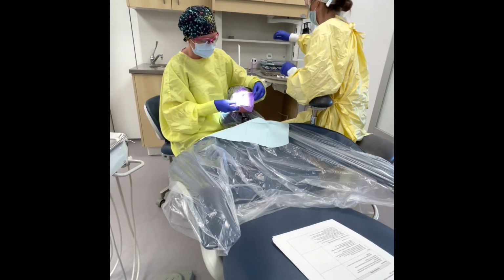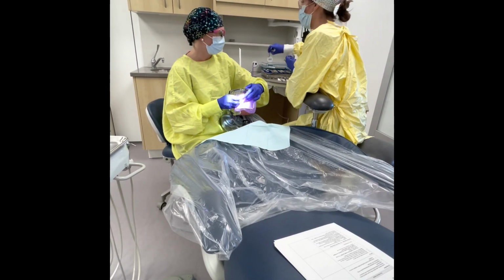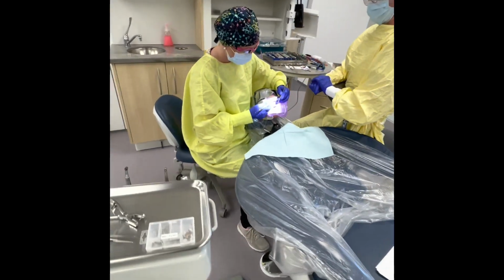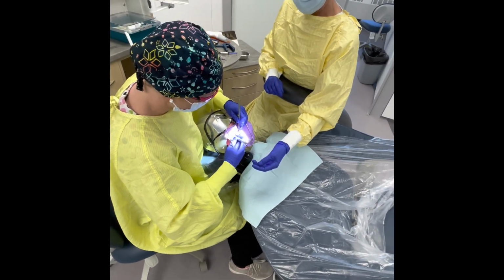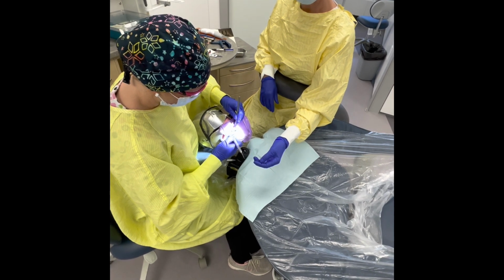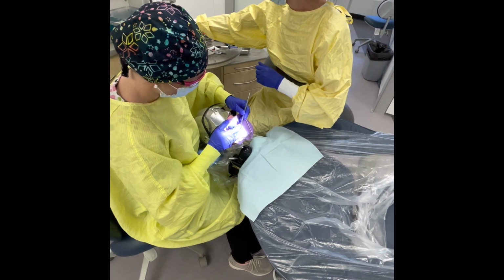Ready to invert the dam, please. So I'm going to pass Amanda the mirror and a PFI. There you go. Your operator will invert the dam. And once she's done that, I'm just going to take the PFI back because she'll keep her mirror as she will need it to do her high speed and her low speed.